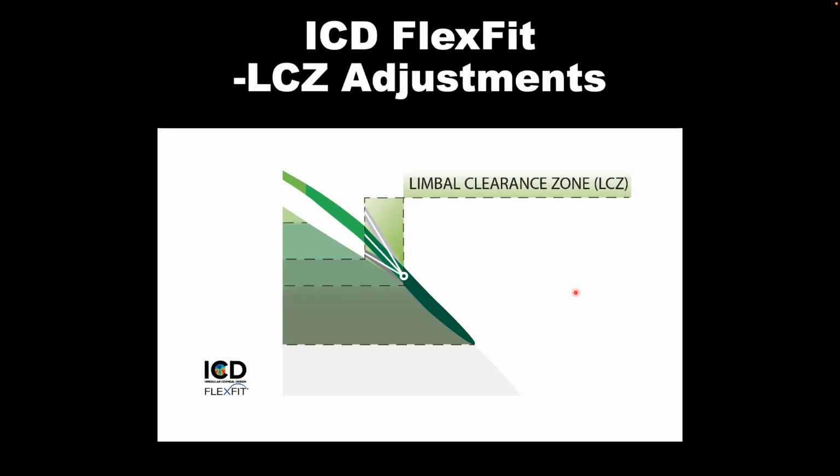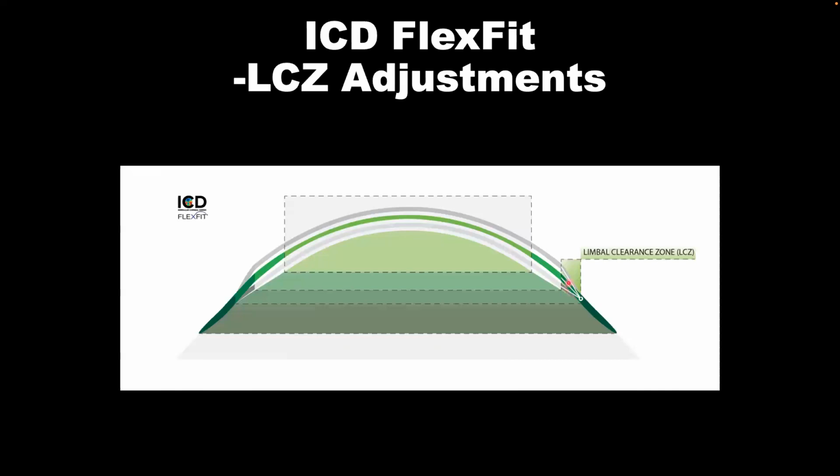So whenever you're seeing heavy bearing of the lens in the limbal area, you may want to go +5, taking into account that the lens will drop eventually. But here's the tricky part. Let's say you make a +5, but you already have a good 300 microns. I usually prefer to have 400 microns when I'm putting the lens on. I just feel comfortable with that, because, like I was telling you, the lens will settle eventually.